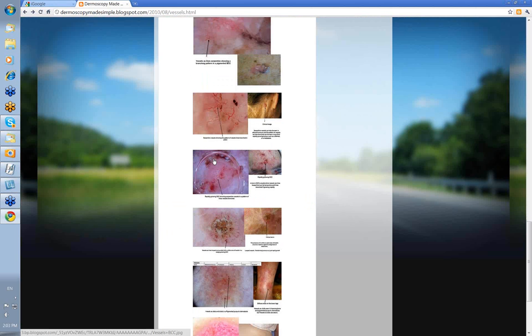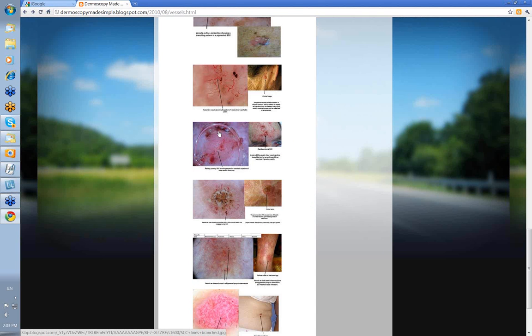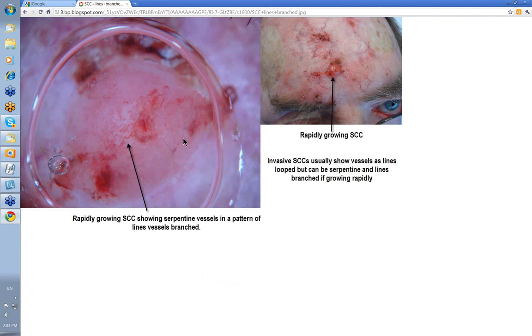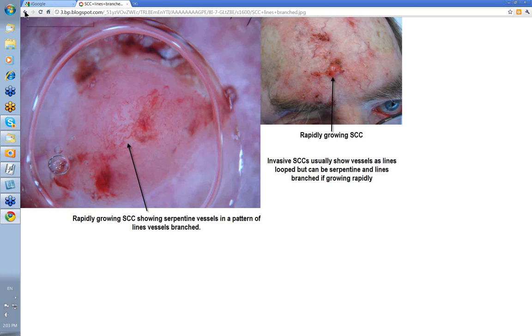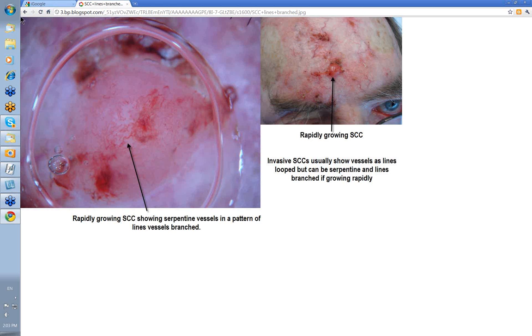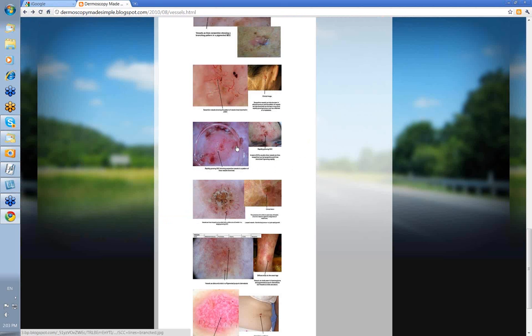Vessels are a help but they're usually the last thing you look for. We were talking about vessels in a branched pattern with any rapidly growing tumor. This lesion was a rapidly growing SCC, and when you had a look at it under the dermatoscope, there were a lot of serpentine vessels in a pattern of line branch. It's just that any rapidly growing tumor will in fact show this. So that was an SCC, not a BCC.